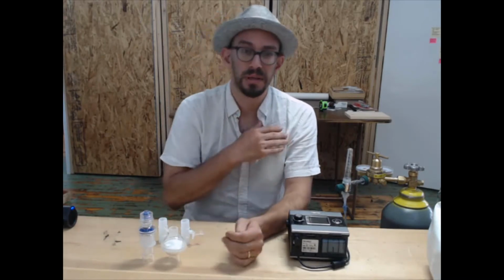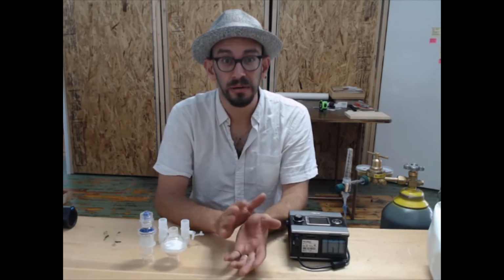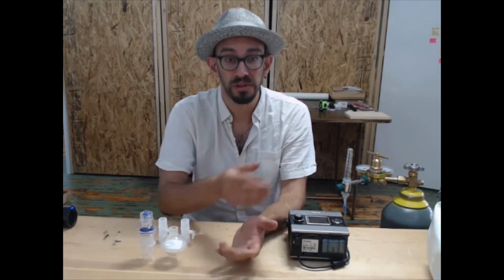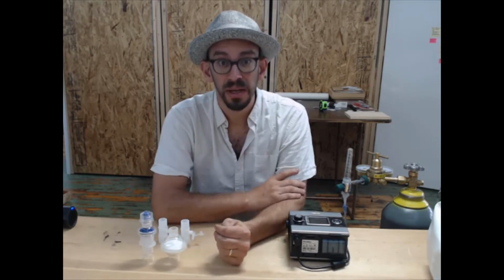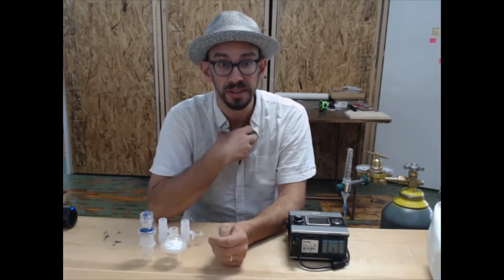So, before getting into the details, I want to just go over the general principle and the goals of this circuit. This is a non-invasive ventilation circuit put together specifically with the goal of treating COVID-19 patients and the goal of delaying or preventing intubation of a patient that's having respiratory difficulty.